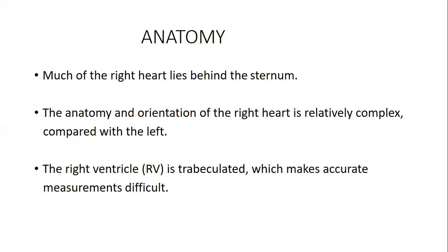structures within the right ventricle, things like the trabeculations, that may make it difficult for us to assess and give accurate measurements. And then you also find that because of those trabeculations, and the fact that if the indication is not to assess the right side of the heart, we don't do much of the things. So in this discussion, I just want to concentrate and also give some emphasis on some few points that we sometimes take for granted as we do an echo.